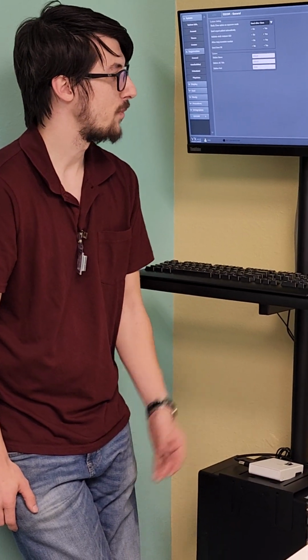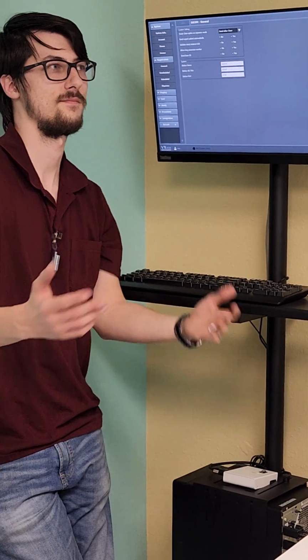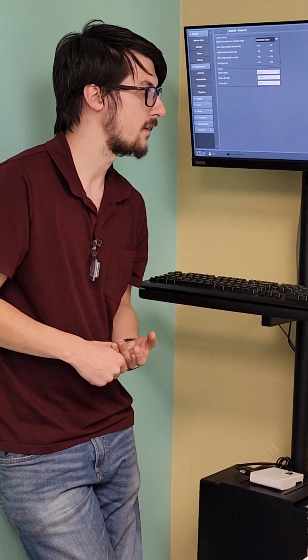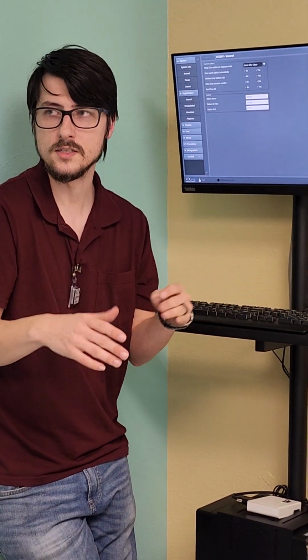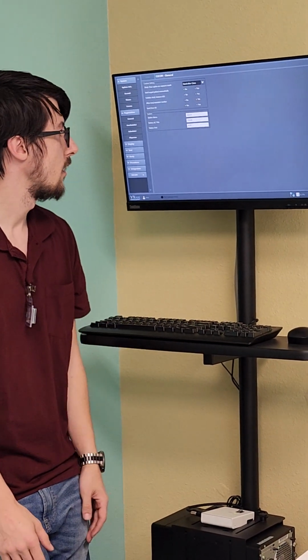I think it has a terabyte of storage space, so it's going to take a while. But once you start seeing it increment up to like 60-70%, you're going to think about it, like, let me give them a call and see what I can do. If y'all just buy the hard drive and plug it in, I can remotely log in and set it to send everything, so I don't have to come out and do everything for you.